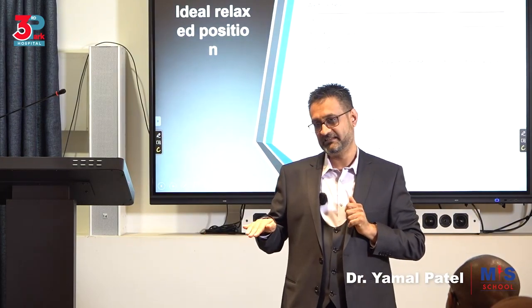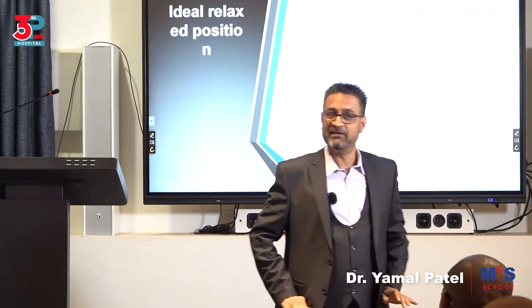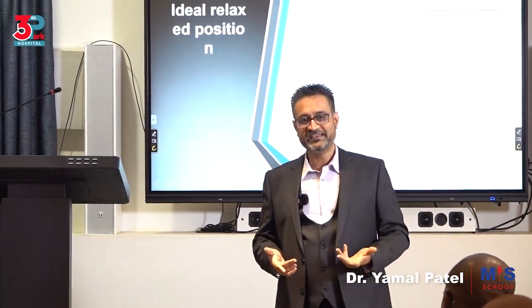So if Joy, who is shorter than me, is my assistant, and I put it at my level, for her it might be high, so she'll be doing this. So what does she have to do? Maybe put a stepping stool, stand up, and come this way, and then operate. You get it. So have a stepping stool in theater that someone can use if they have to.